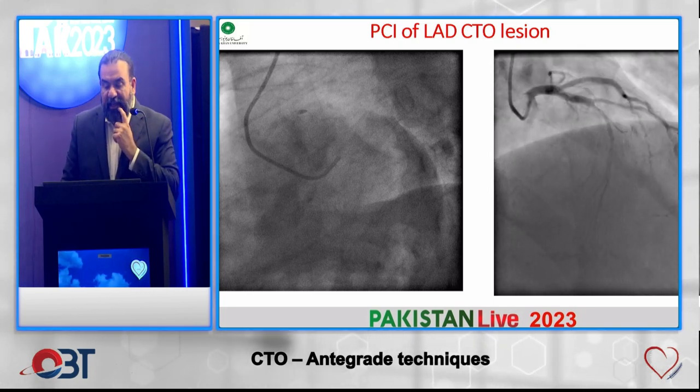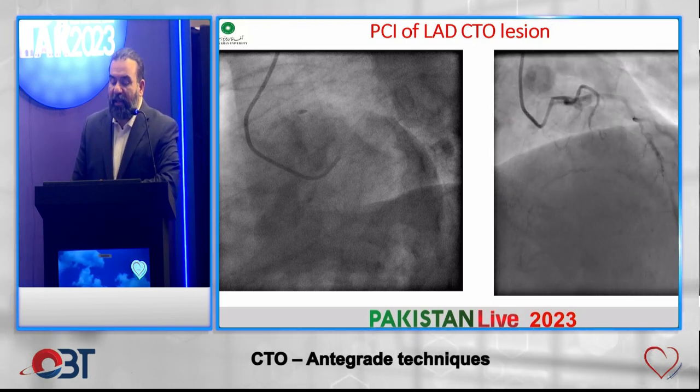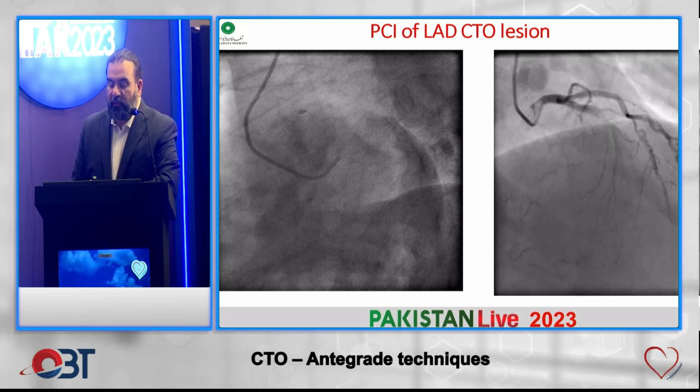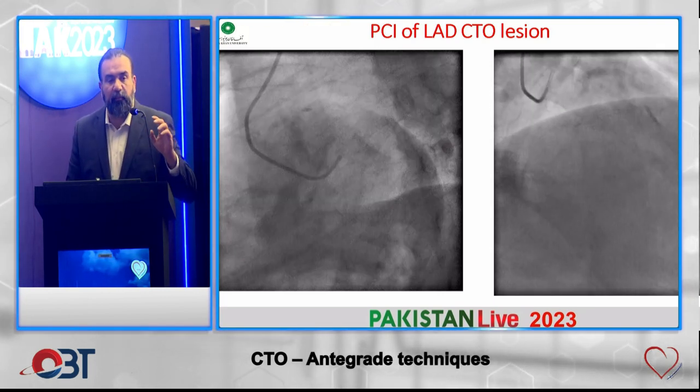And I think what this highlights nicely is that in your cranial view, it looks like there's a stump there, there's a taper, but then it peters out. And in fact, that might be just a branch of the septal. But when you see this spider view, caudal, you can see it's fairly blunt.